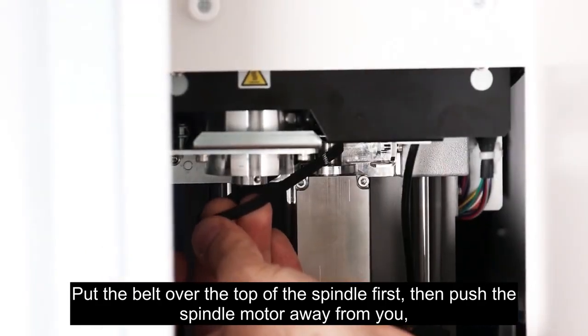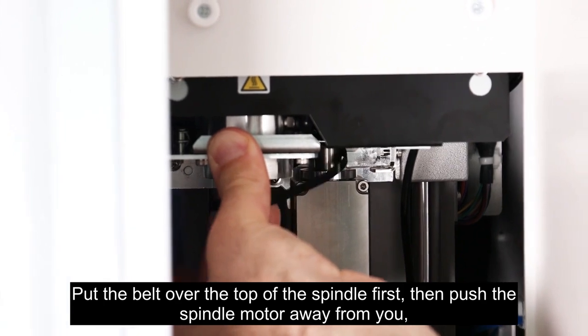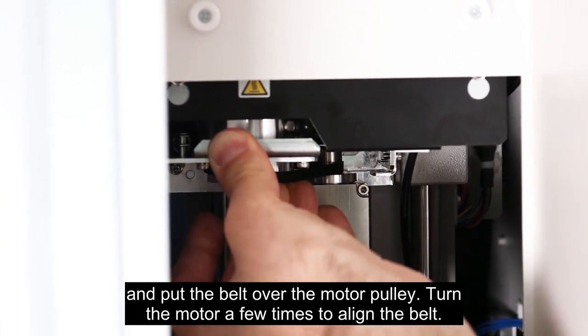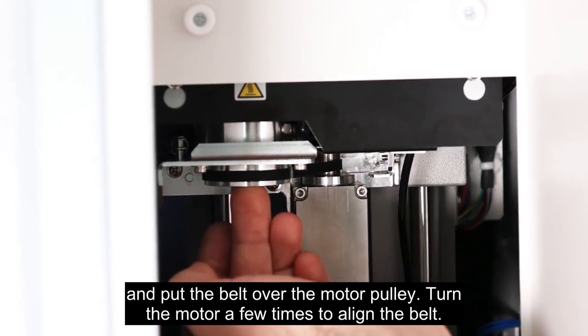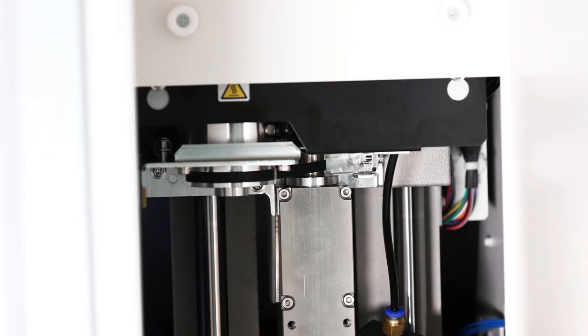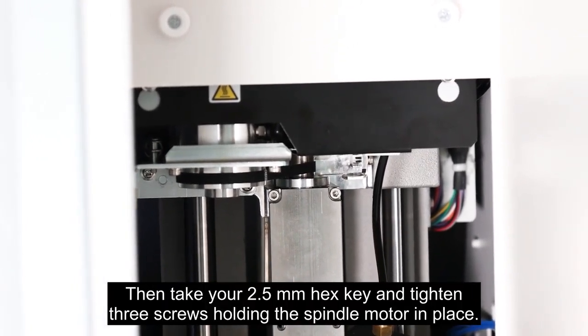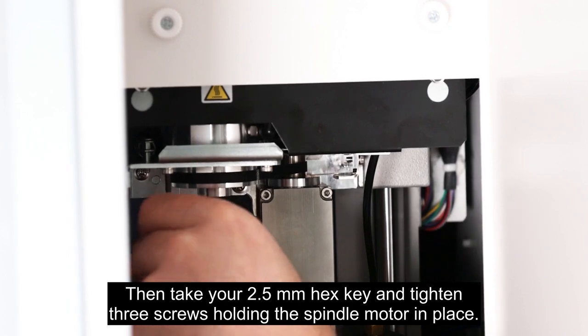Put the belt over the top of the spindle first, then push the spindle motor away from you and put the belt over the motor pulley. Turn the motor a few times to align the belt. Then take your 2.5mm hex key and tighten 3 screws holding the spindle motor in place.